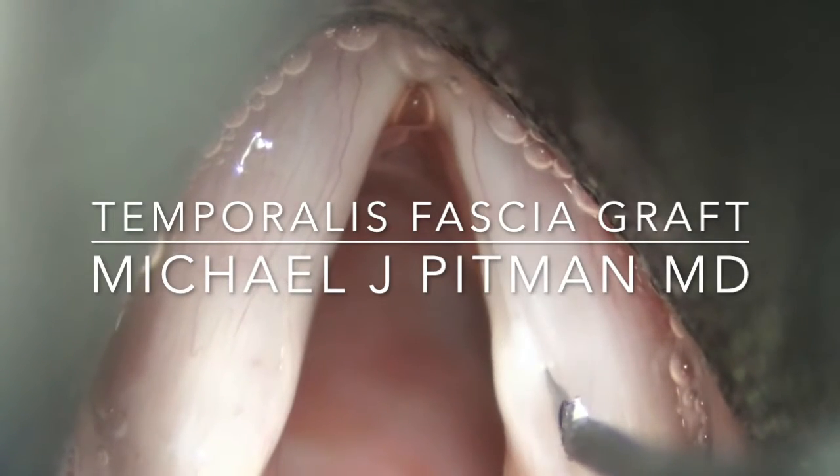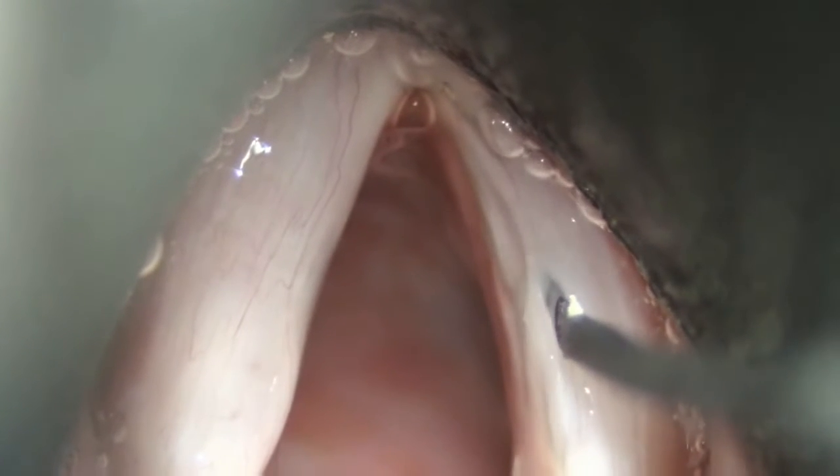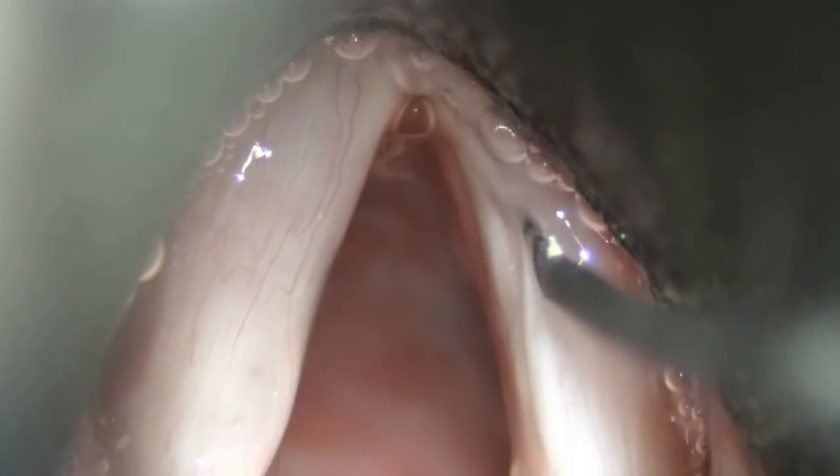This is a video describing how to do a temporalis fascial graft. First, an incision is made just lateral to the superior surface of the sulcus.